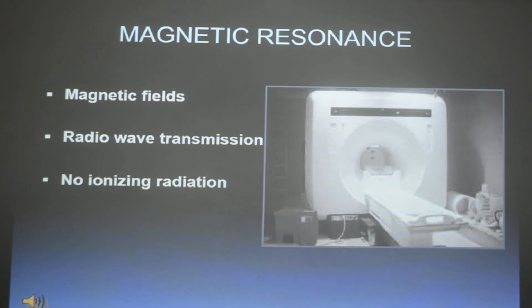Okay? Just remember, these protons are lying inside this big huge magnet. You give a current from outside, they start aligning according to this external source current which has a magnetic field now. You turn off the field, they try to return back to that same strength or same field that was initially there.